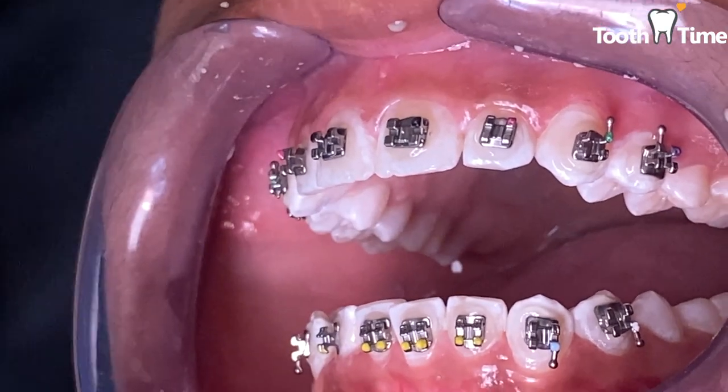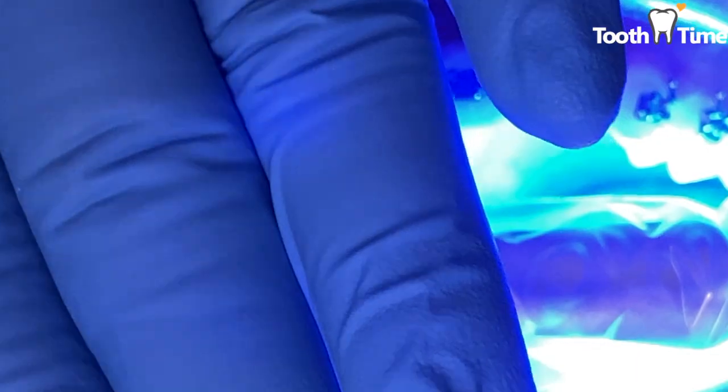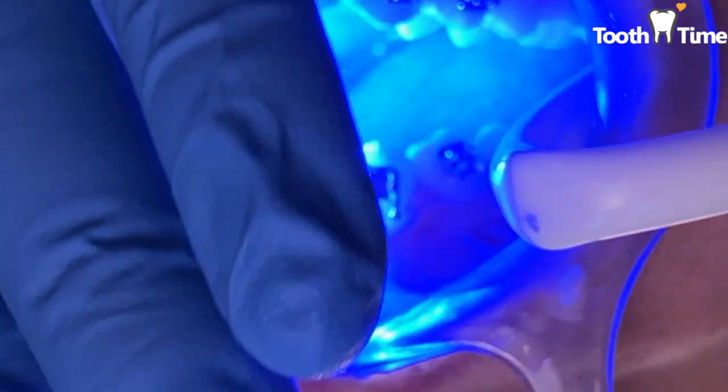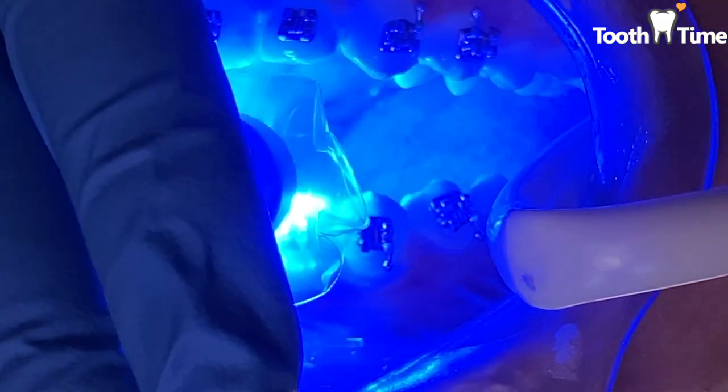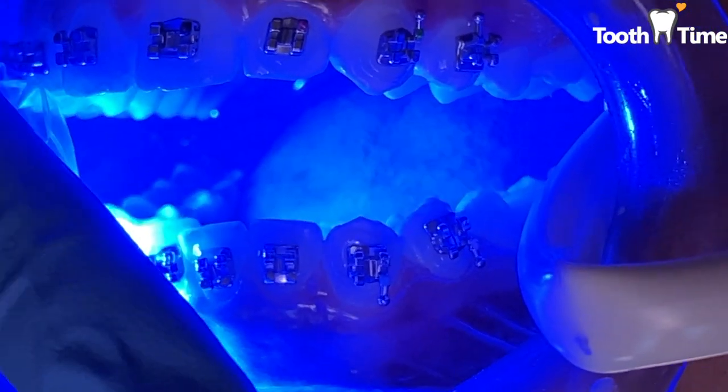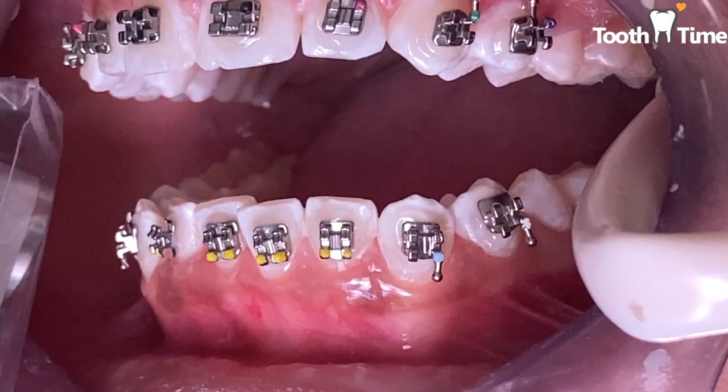You always have to make sure that whenever any dental technician uses this curing light, you have to use orange goggles or keep your eyes closed, because it's very bright and it can hurt your eyes. Once we're curing, this part takes a while so it's just kind of a waiting game.